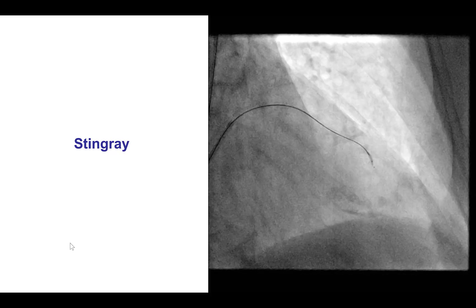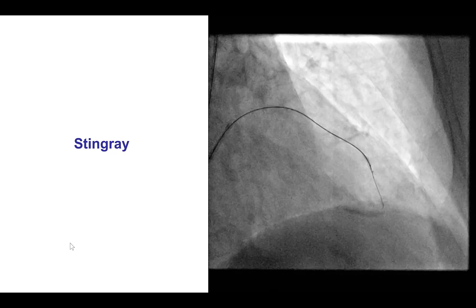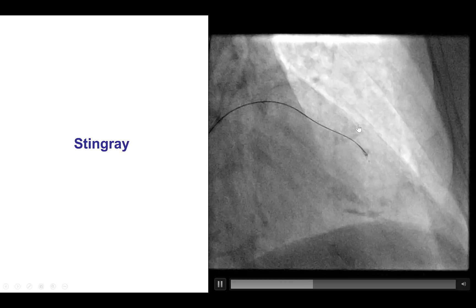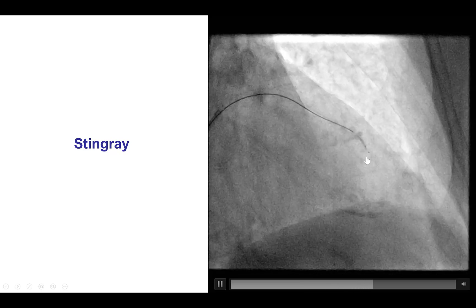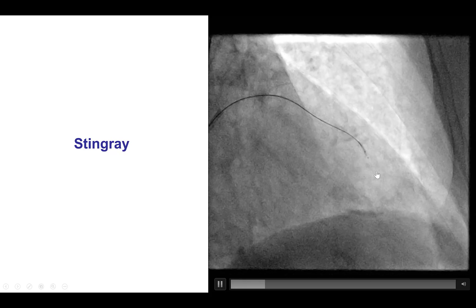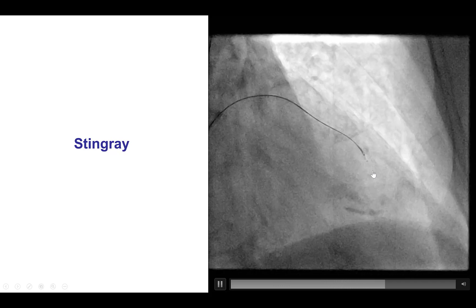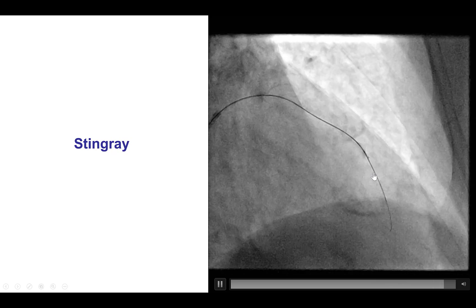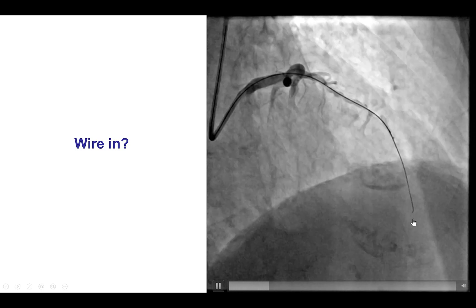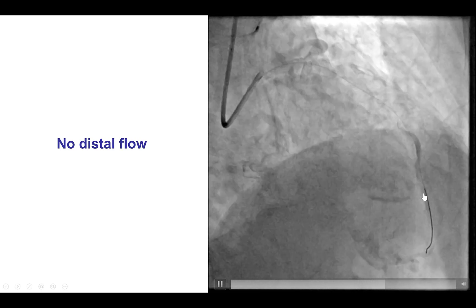In this case the LAD was a large vessel and we decided we had to obtain access. We were unable to advance a workhorse guide wire and eventually decided to use antegrade dissection re-entry using the stingray balloon to re-enter into the distal true lumen. Here is the stingray balloon advanced distal to the area of dissection, performing the double blind stick and swap technique. Initially the wire goes between the two markers proximal to the proximal marker, then it is pulled back and redirected, and now the wire goes between the two markers. Unfortunately, flow was stopped distally so we could not confirm whether we were in the distal true lumen, although there seemed to be still persistent dissection in this area.